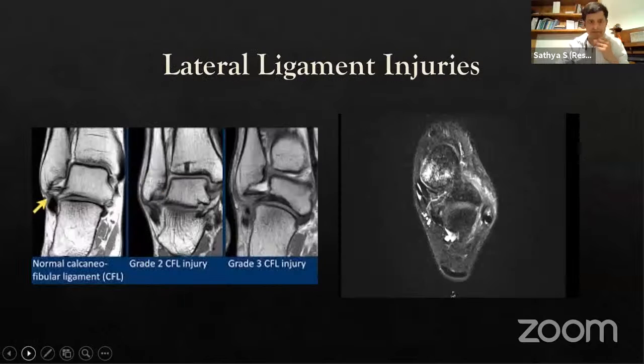Okay, so here I'm going to show you a lateral ligament injury, which I showed you before. This is the MRI, the T1 weighted image and a T2 weighted image. A T1 weighted image will tell us the bone structures and the soft tissue structures, which look grayish, versus the fluid structures, which will look much darker. In a T2 image, the bone structures and the soft tissue structures will be much darker, and the fluid structures will be much whiter. So it'll be able to glow.